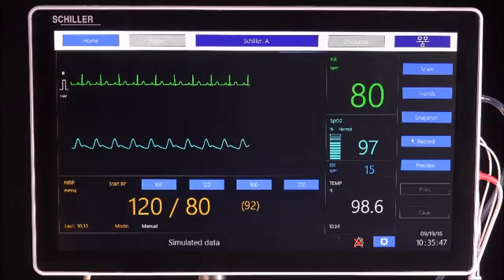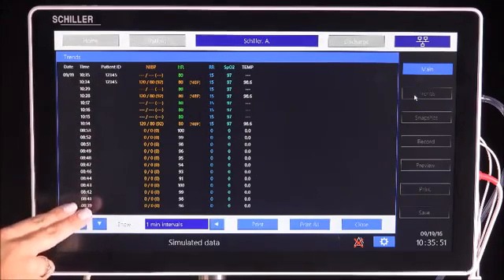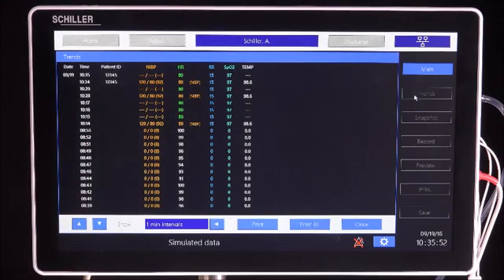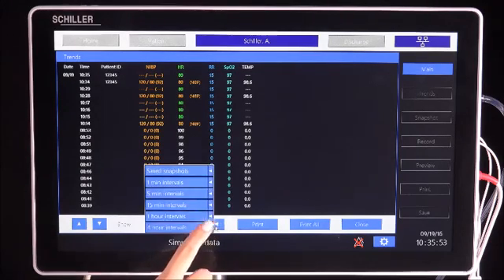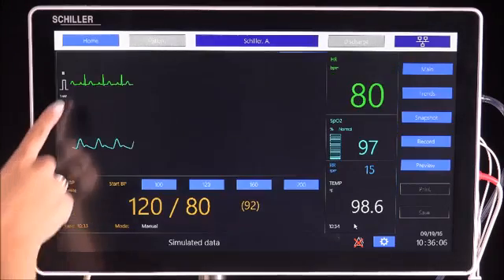The DS20 records up to 72 hours of trend data. The trend values are displayed at the user-defined interval and additionally after every manual NIBP measurement. The display for the trend table can be selected for intervals or saved snapshots.